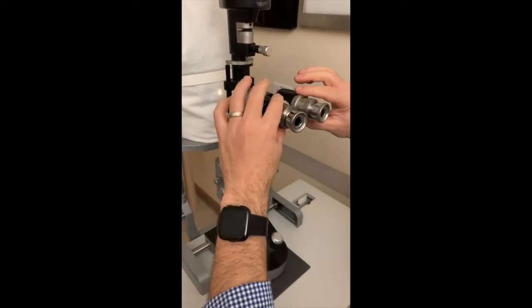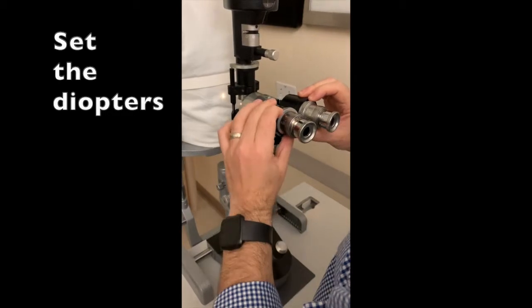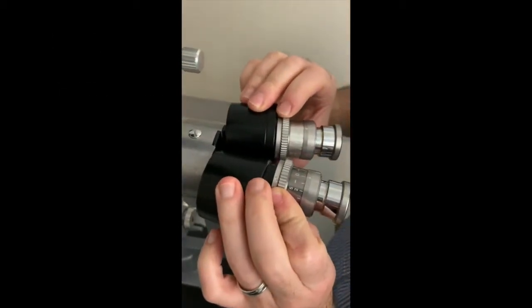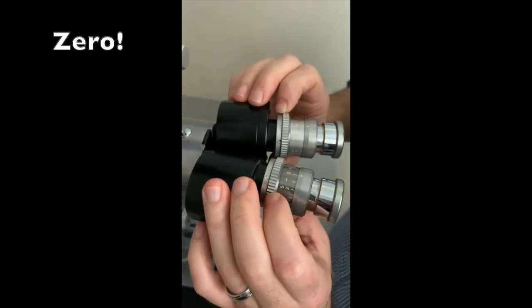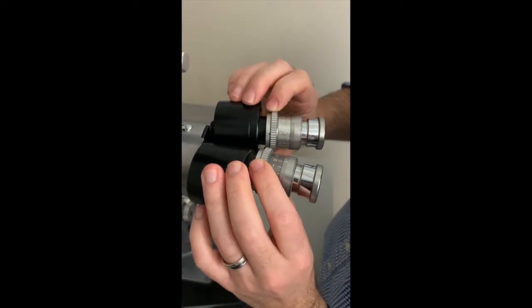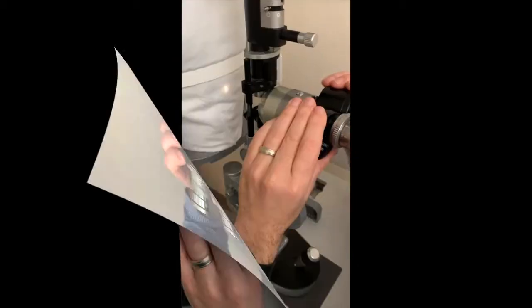The next thing you need to do is set the diopters. They should be set to zero for most people. So usually for people with normal vision, setting the diopters on each eye to zero is where you want it to be.